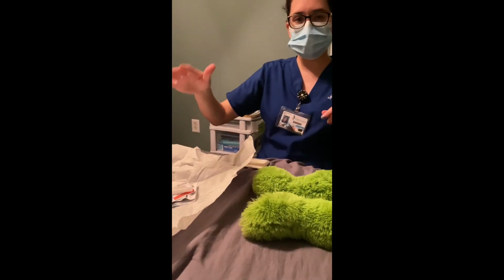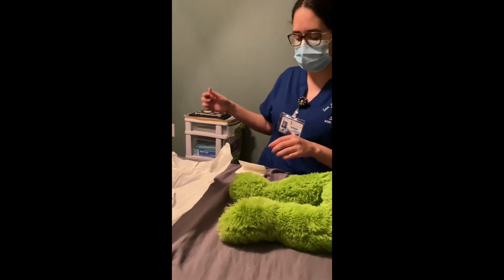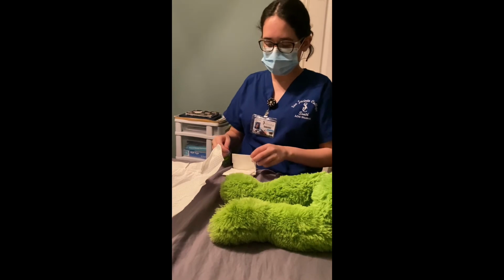Okay, so this is going to be my working sterile area. So now I'm going to apply my gloves after performing hand hygiene one more time.